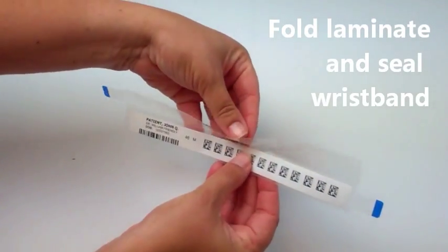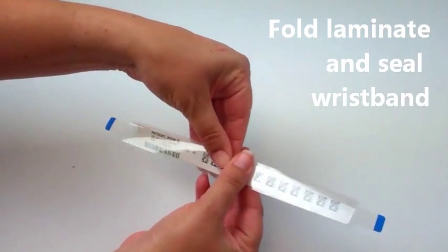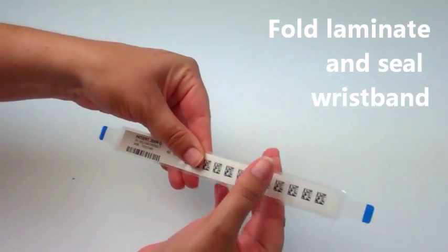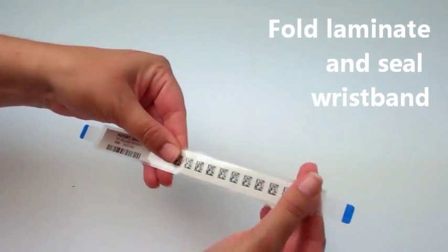Fold over the laminate in the middle of the band, then press down from the middle outward to seal the wristband. Make sure there are no bubbles or creases.